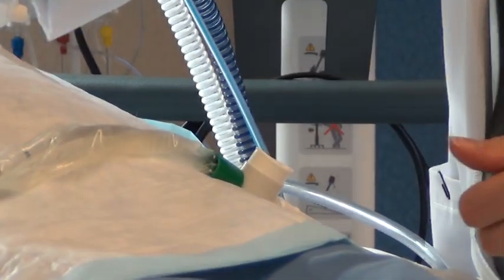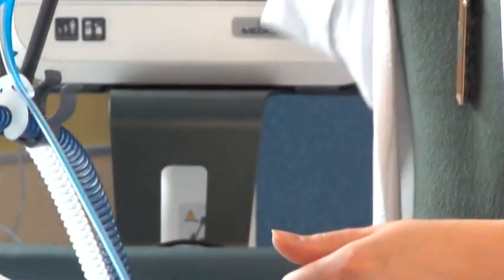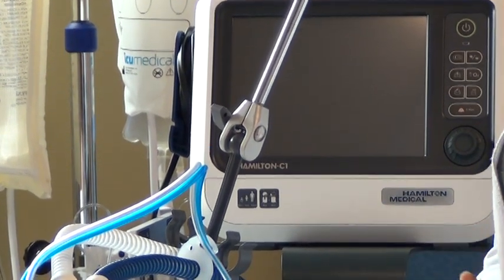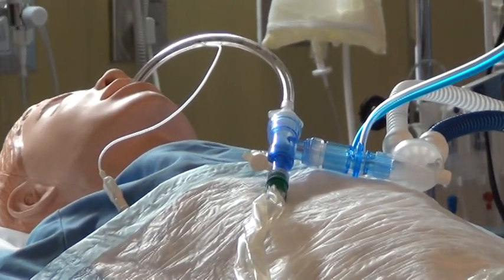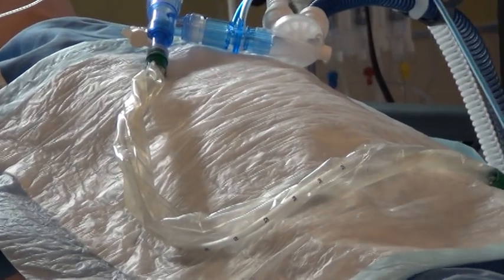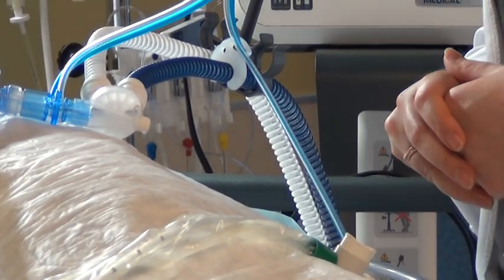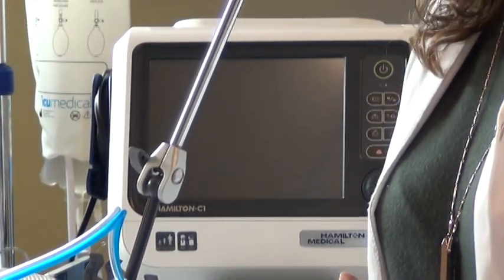Before we suction our patients, we normally would give them 100% oxygen, there's a button on the monitor that we are able to press. So it's a bolus of oxygen. We call it pre-oxygenating our patients prior to suctioning them. The reason we do that, and we especially do that in pediatrics, is that as we suction secretions out of the patient, we're essentially sucking out the air as well. So patients feel very breathless, evidently, when we suction them. So we do try to make it as quick as possible, but ensuring that we remove the secretions that need to be removed.